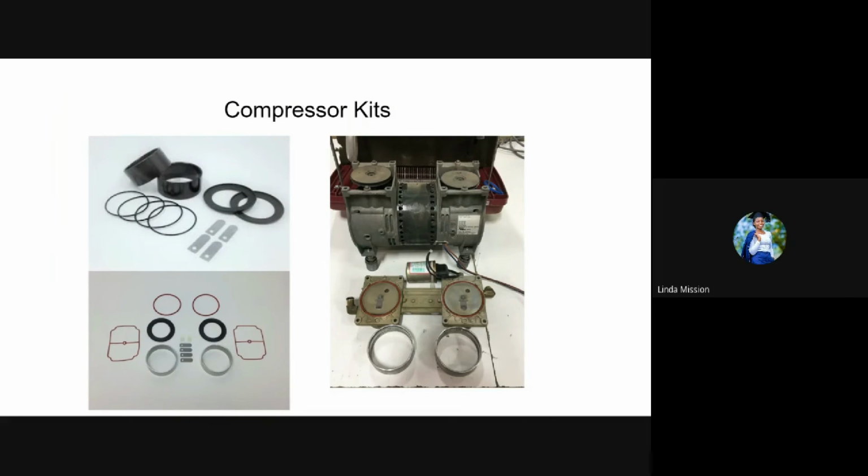The compressor is one of the main components in an oxygen concentrator. When a compressor is worn out or defective, its output pressure, which is required for the nitrogen adsorption process in the sieve bed, decreases, resulting in low oxygen concentration. The compressor typically used in oxygen concentrators is double-headed and oil-free, and it is secured to the unit on the base via shock absorbers and 4 motor mounts.